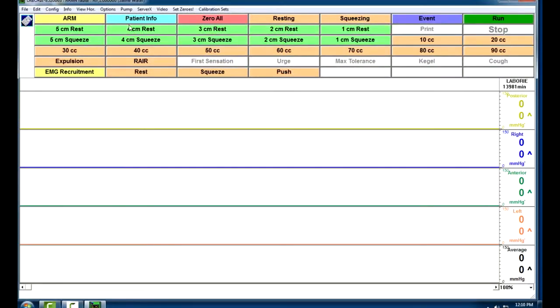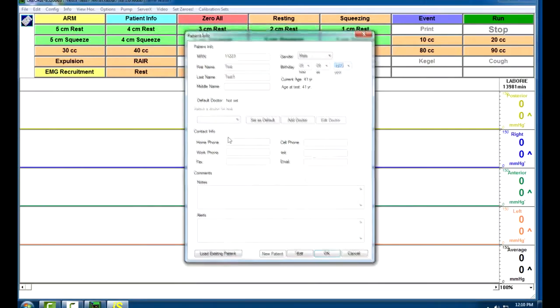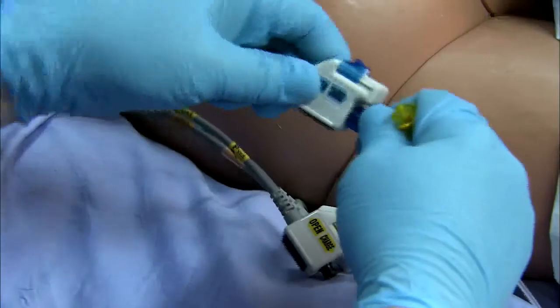At this point, it'd be a good idea to go ahead and enter your patient information. The numbers need to be unique, as well as the patient's name. You can pull up tests from former patients and add their names and numbers. We'll pick a male, born in May on the 9th in 73. We can also default in the physician's names in this section right here.